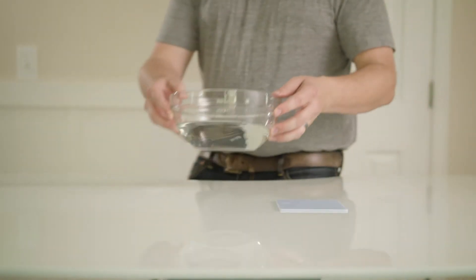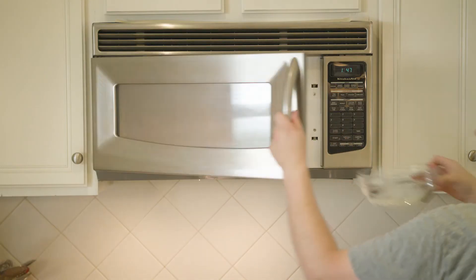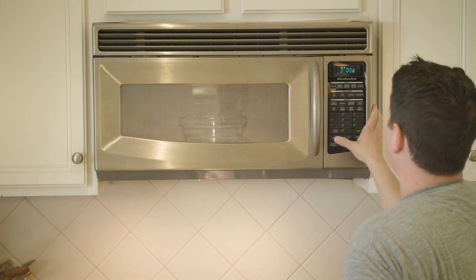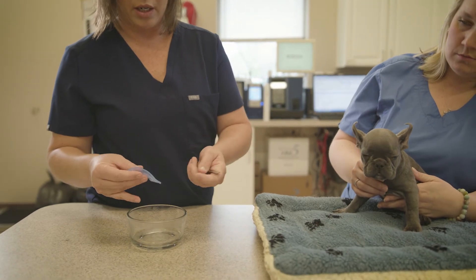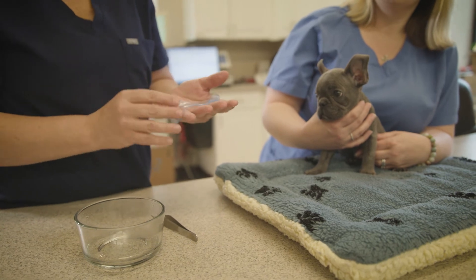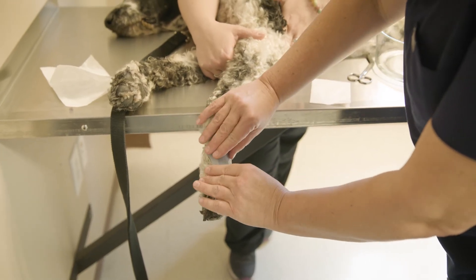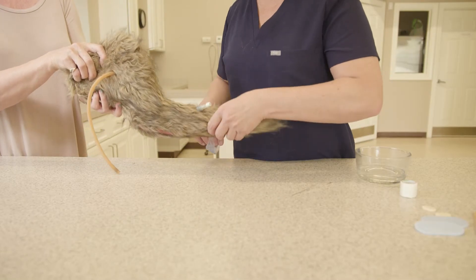What I tend to do is get a glass bowl, put water in it, and put it in the microwave. We're waiting for the material to actually go transparent — that's how we know it's reached the right heat. The water is still very hot, but if you get something to pull it out, the material itself is easy to handle. Once you get it in your hands, it's just like play-doh or silly putty — you're just working it around to get the right shape and density to put on an animal.